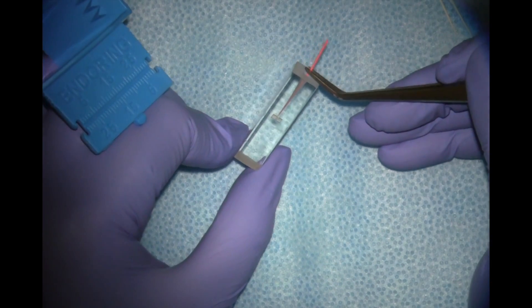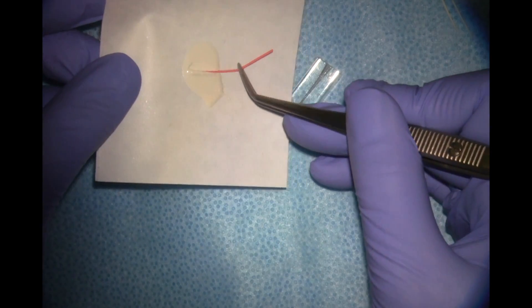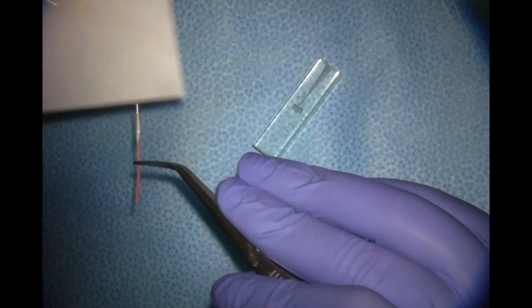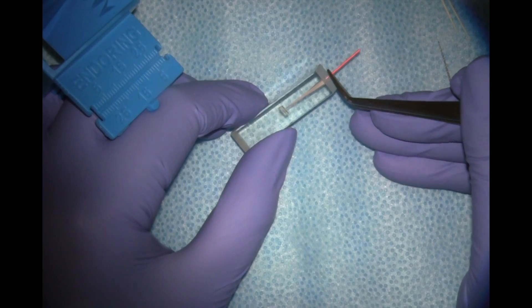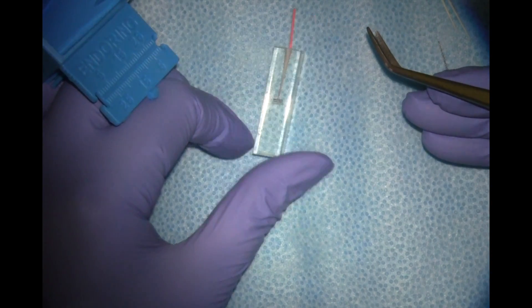Once we're happy with our cone fit, we'll get sealer on our master point — just coat the cone in sealer — and place it in the canal again, ensuring that it goes to length. You can gently pump it up and down to coat the walls with sealer. That's seating our master cone.